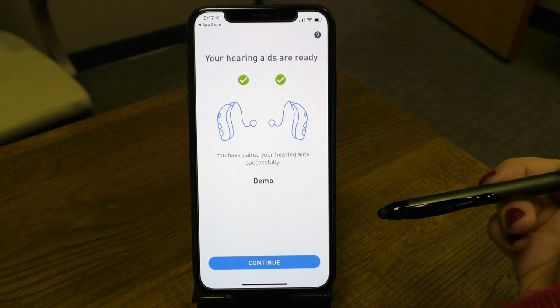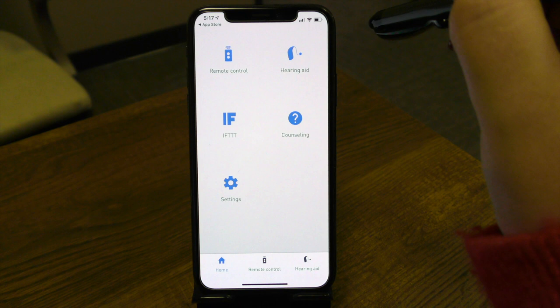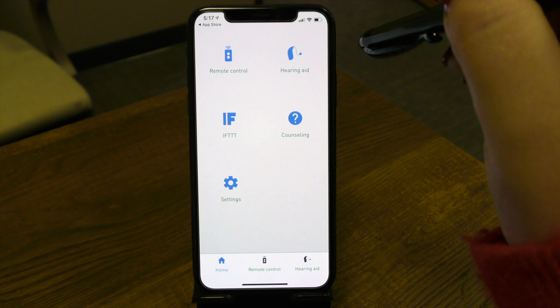Notice now we have our screen showing that our aids are paired to the app and that we're ready to use the devices. So let's go ahead and continue. This is your overall dashboard screen. From here, I'll walk through each of the features so you can see how to best use the app and how it manipulates the hearing devices.